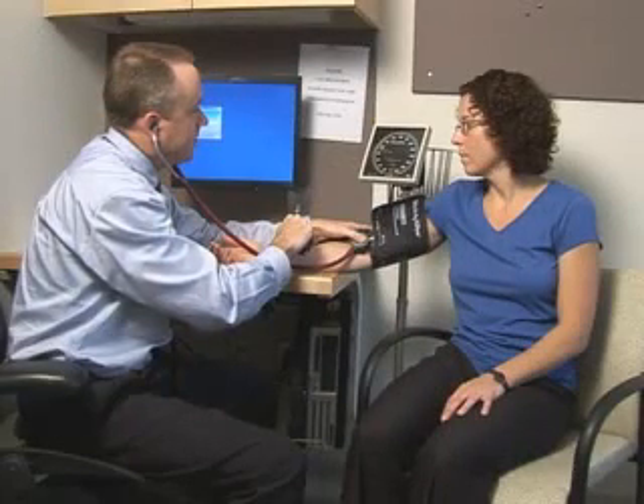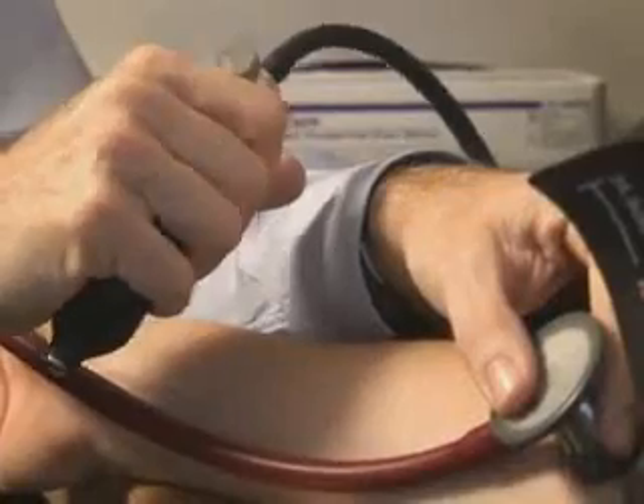In the routine outpatient setting, blood pressure is measured indirectly. Thus, it is important that proper techniques be used in order to produce consistent and reliable readings.